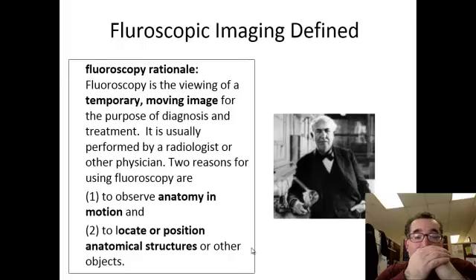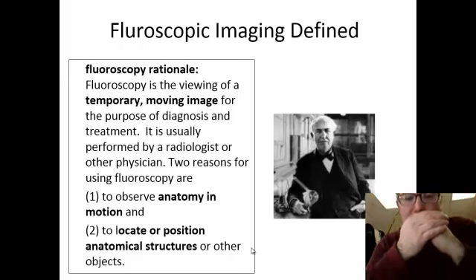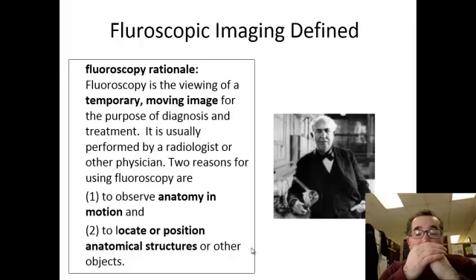It could also be utilized to locate the position and look at anatomical structures. It gives the radiologist a lot of flexibility that we don't have generally as a technologist, whereas they can oblique the patient, for example. They could get them just into the right obliquity for them to possibly see what they're interested in, whereas we go by standard measurements and angles with which to provide our overheads.